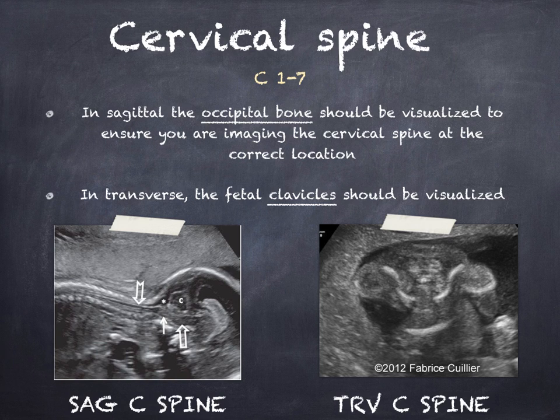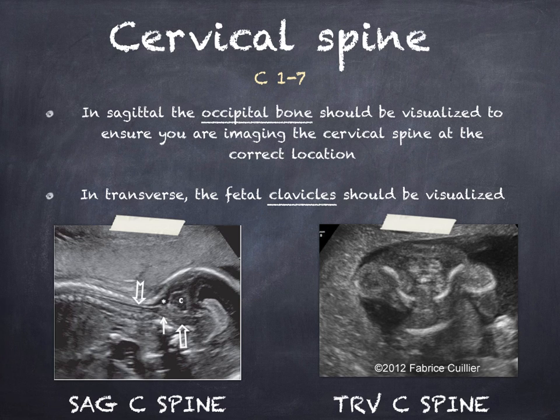Landmarks are helpful in showing the radiologist what area of the spine is being evaluated. The cervical segment is the most superior portion of the spine. The landmarks for this segment are the occipital bone and the clavicles for the transverse view.